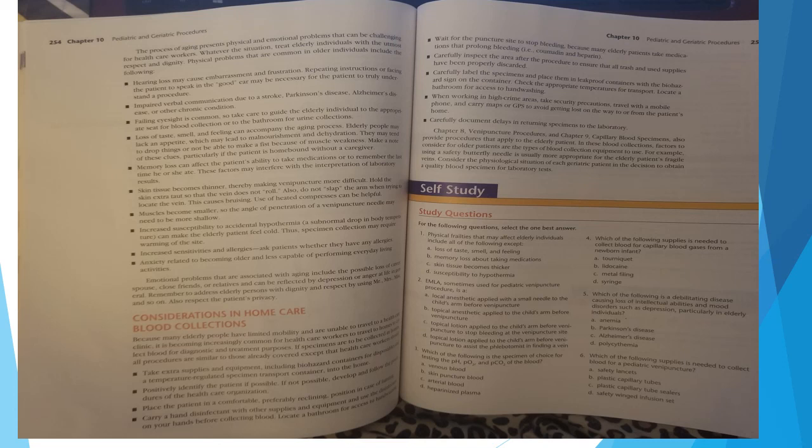Because many elderly people have limited mobility and are unable to travel to a healthcare clinic, it is becoming increasingly common for healthcare workers to travel to homes to collect blood for diagnostic and treatment purposes. If specimens are to be collected in homes, all procedures are similar to those already covered, except the healthcare workers should take extra supplies and equipment, including biohazard containers for disposables and a temperature-regulated specimen transport container into the home. Positively identify the patient if possible. If not possible, follow the procedures of the healthcare organization.